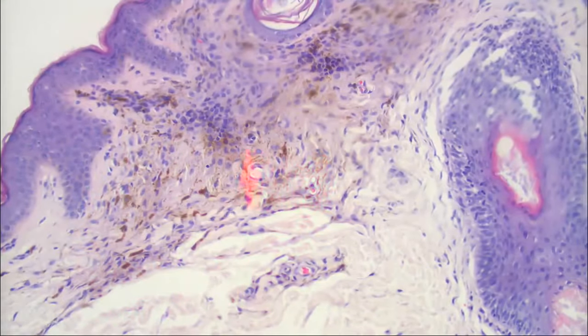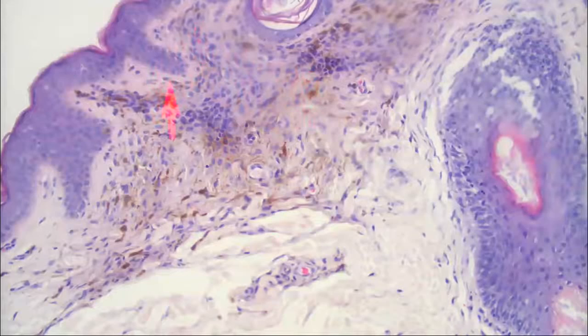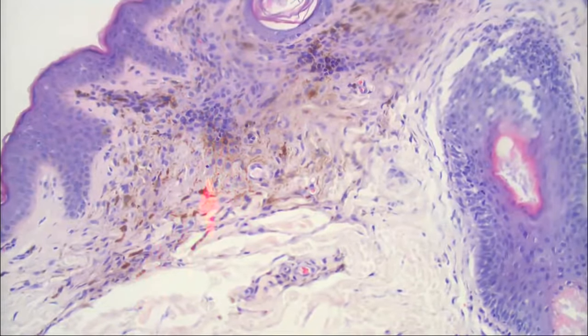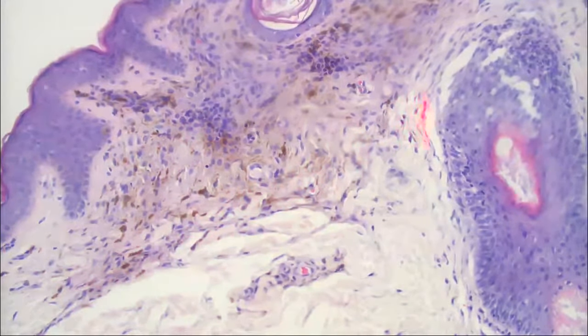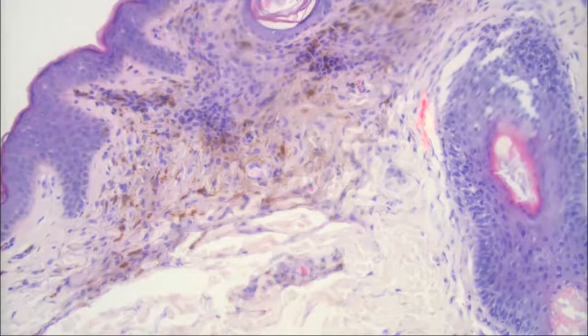A blue nevus. So we have a blue nevus, and then we have more of a common intradermal nevus component. So what do we call that? Intradermal blue nevus? A combined nevus. Combined blue nevus. So that's what this is. This is a combined blue that they just look like a blue nevus when you look at them clinically, so the slides don't really matter much.